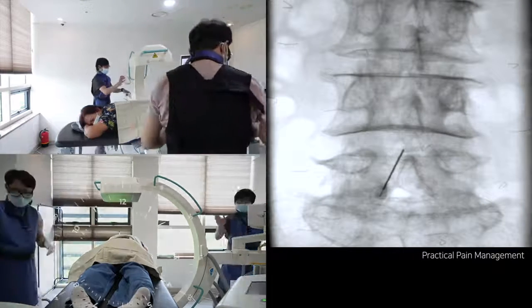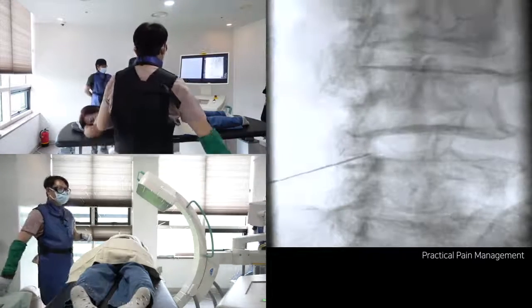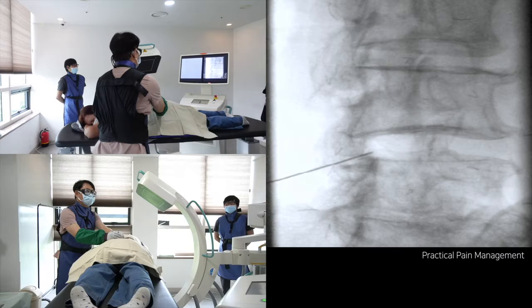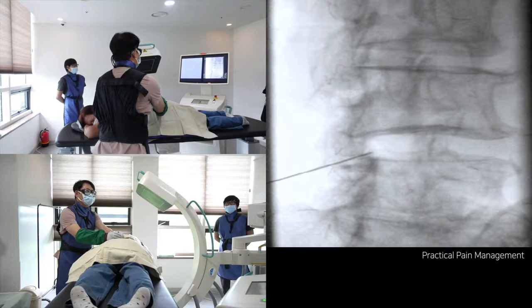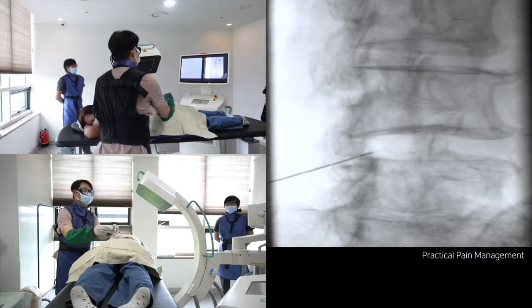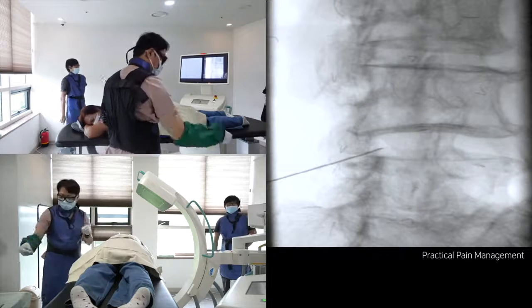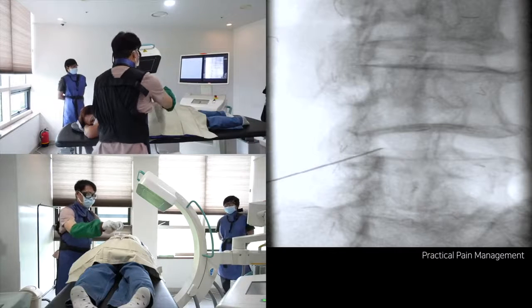Please turn to the contralateral oblique image. The compass shows a 45-degree contralateral oblique rotation. The typical view of the contralateral image shows a tangential view of the pedicle, laminar, and interlaminar space — please put this image in your memory. If the needle tip reaches the interconnecting line of the inner aspect of the laminar, slow down the movement, focus on the tactile feeling, prepare to stop moving, and connect to the contrast-filled mini-volume extension line.